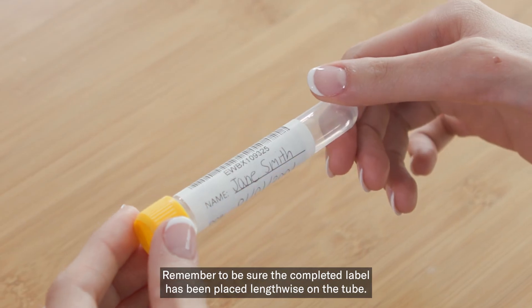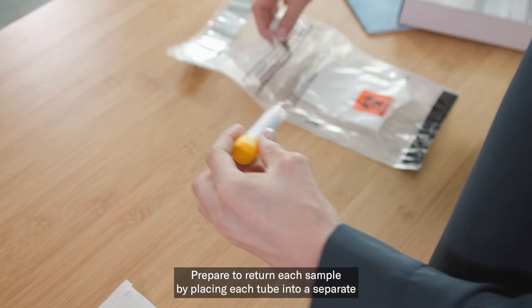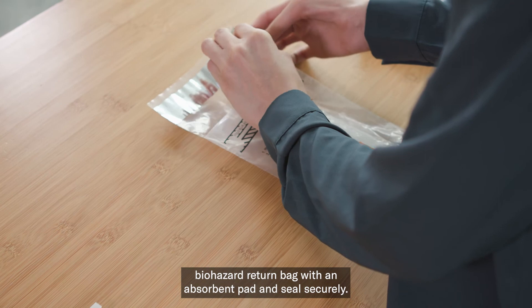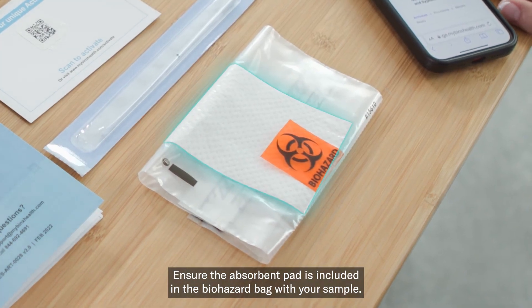Remember to be sure the completed label has been placed lengthwise on the tube. Prepare to return each sample by placing each tube into a separate biohazard return bag with an absorbent pad and seal securely. Ensure the absorbent pad is included in the biohazard bag with your sample.